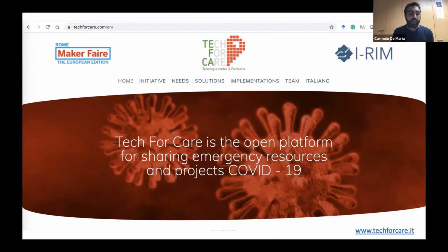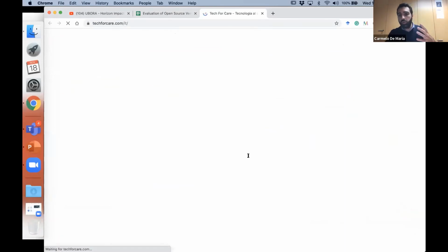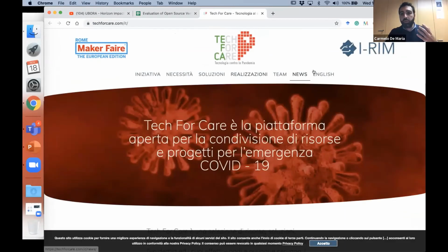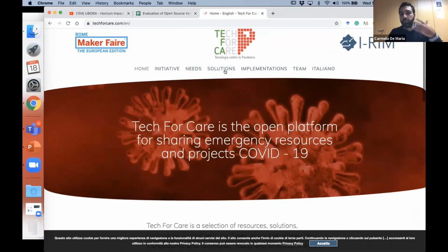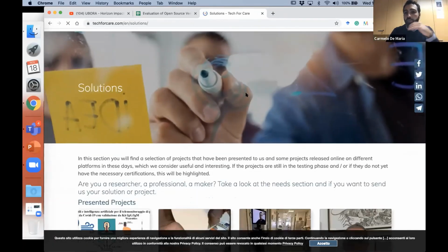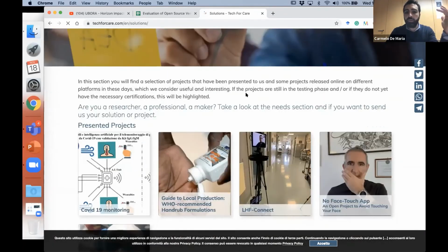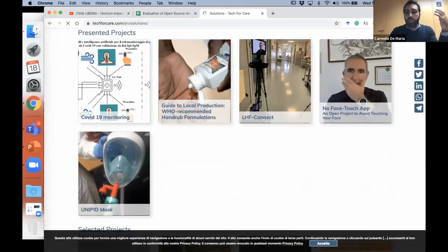And we were asked for vetting these technologies. Just to give you an example, I'm going to this project just to show you how engineering can really work. The solution proposed by EasyNova, the one that is pretty famous, the inventors were super skilled people. However, the pressure drop of the mask does not allow a complete ventilation.